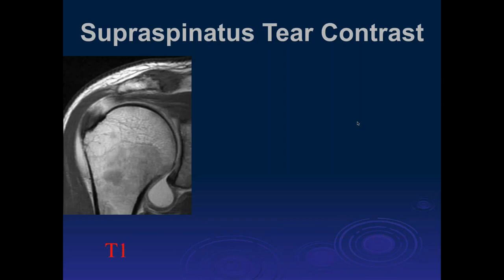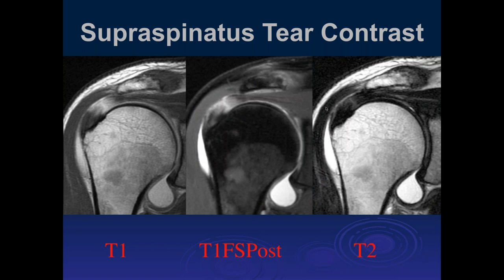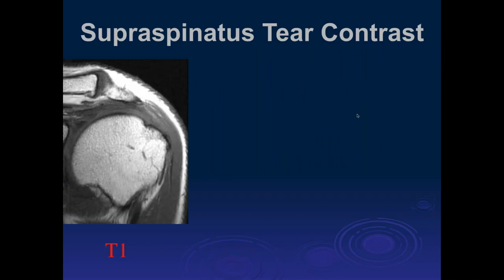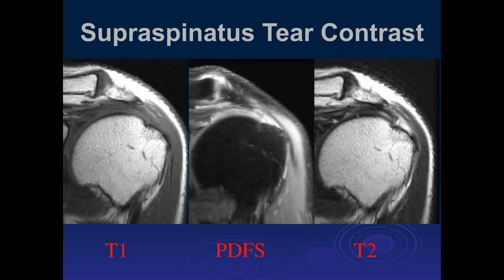Looking at the supraspinatus tendon with arthrogram injection, we can see the tear. The T2-weighted image shows the tear but is much less sensitive than the PD fat sat. If you do arthrography, even the T1 lacks as good contrast for subtle tears. T2 is great for size of the defect, but for tears without fluid filling them, T2 is less sensitive. The edges of the tear are often obscured by severe tendinosis on PD fat sat images.